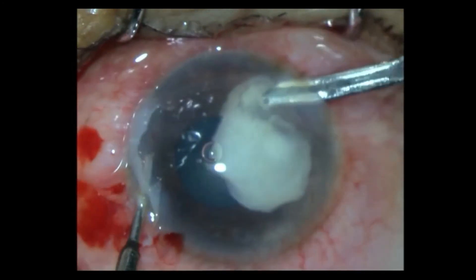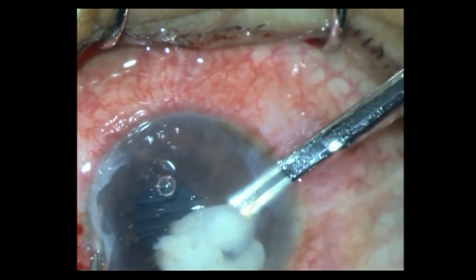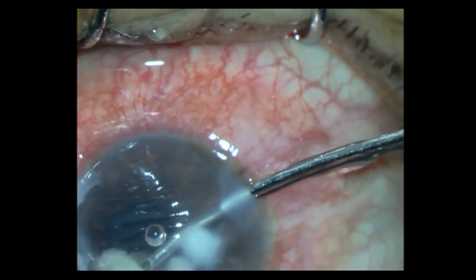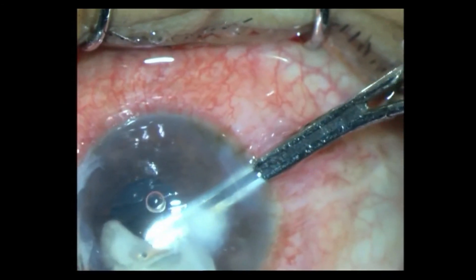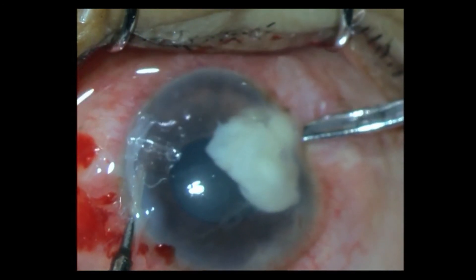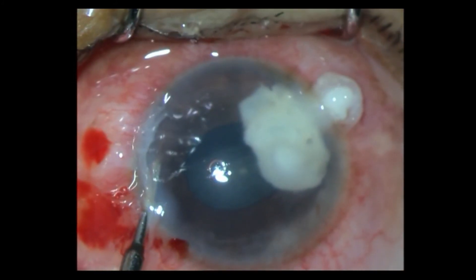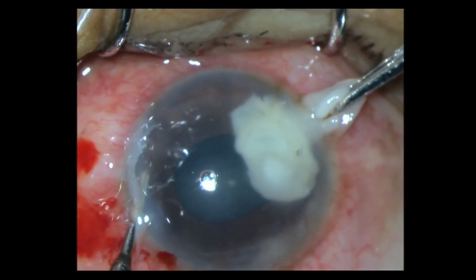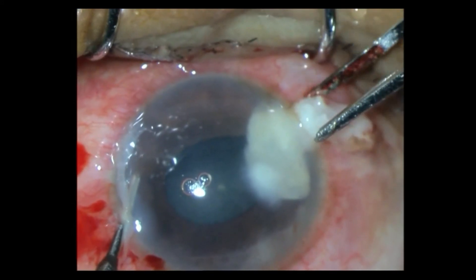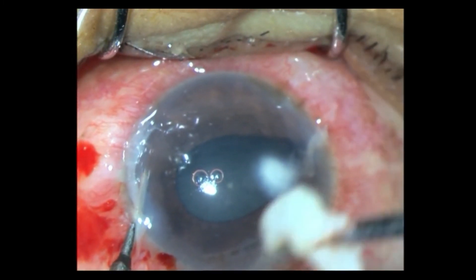I am just trying to get hold of it and bring it out a bit. And there — I have done it. Then using the forceps, slowly pull out all these membranes. And look — after all that mess has been cleared up, how small that ulcer actually is.